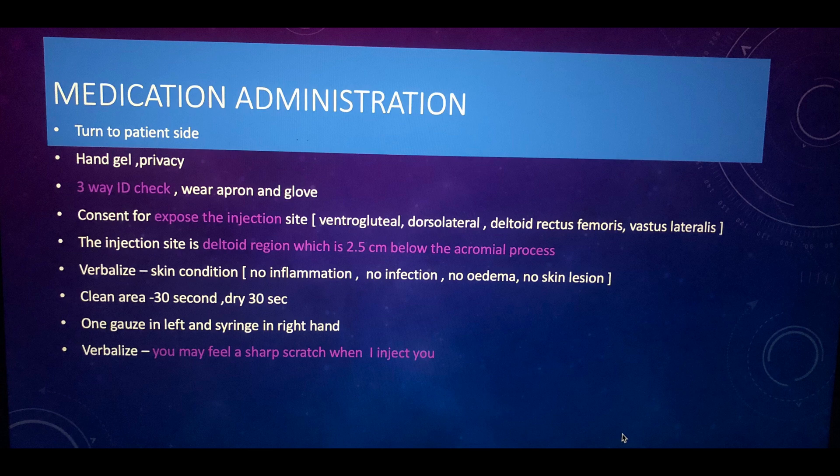Now we are going to the preparation stage — this is Part 2 of IM injection. Here you will load the medication. If it is a vial, clean the tip of the vial with a 70% alcohol swab. If it is an ampoule, take a gauze and place it at the side of the ampoule so that when it breaks you can use the gauze to protect your hand. Then wipe the neck of the ampoule with alcohol wipes.